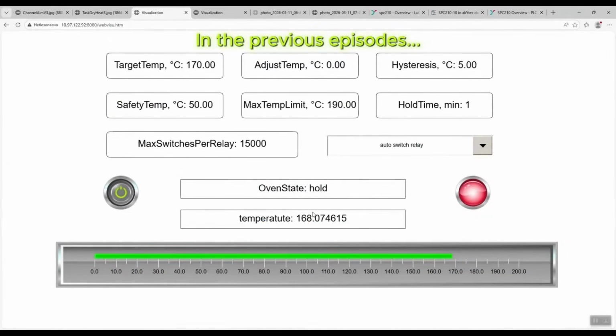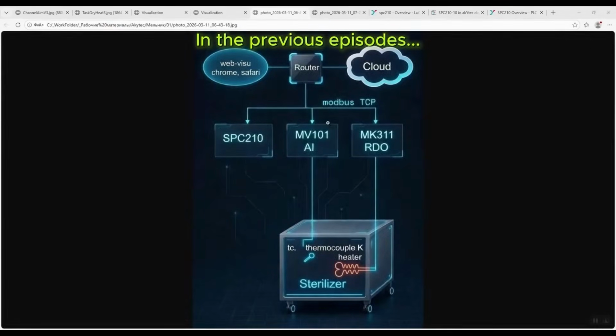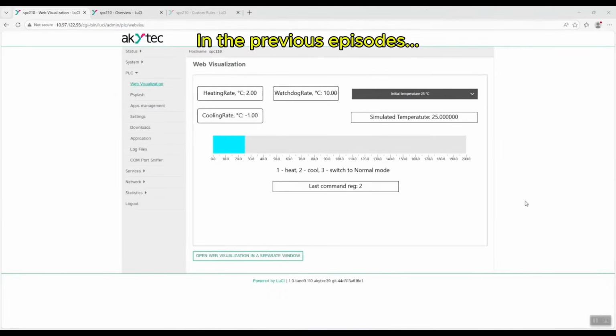Web visualization allows you to control the automated system using any device with a browser, including your smartphone. All the mentioned devices are connected to each other through a router that has internet access. Let's go over the emulator algorithm.